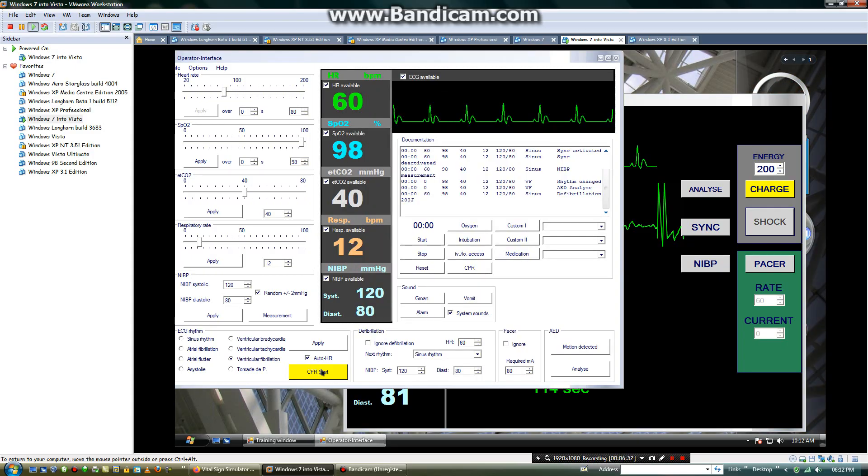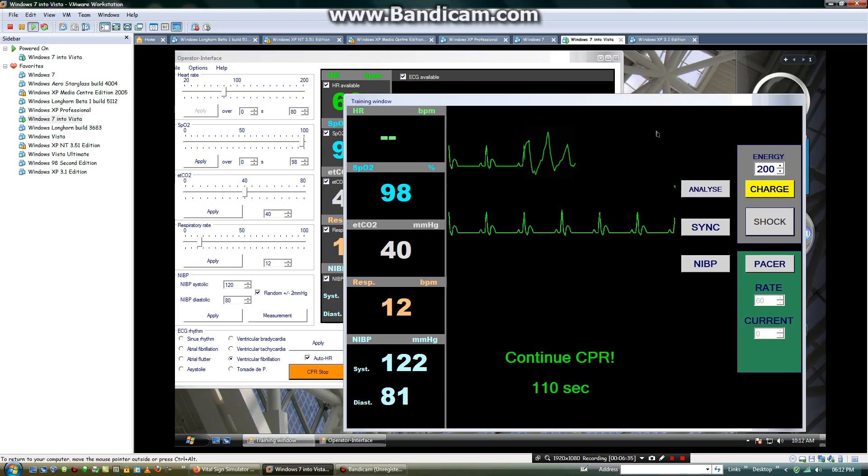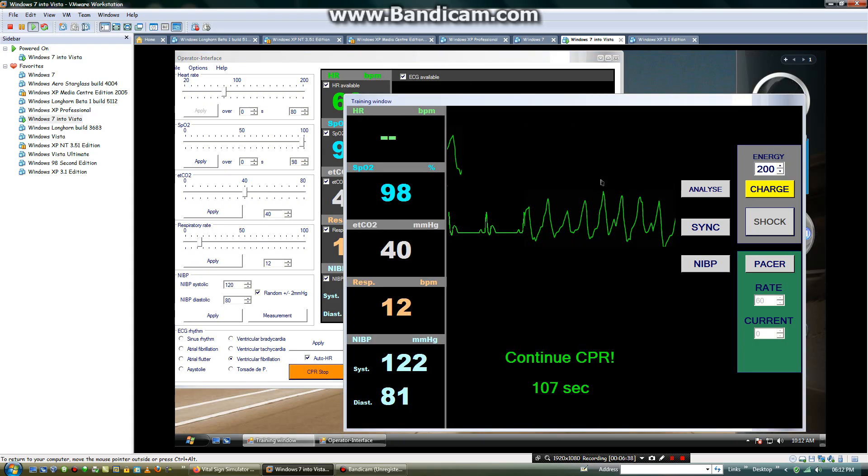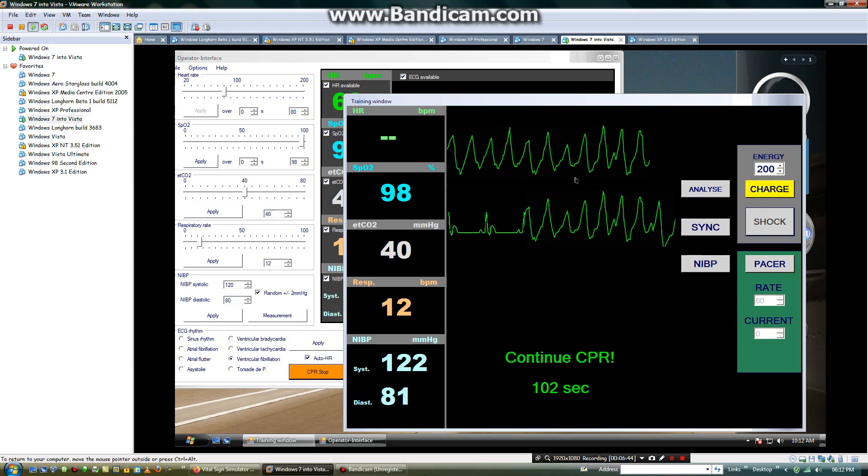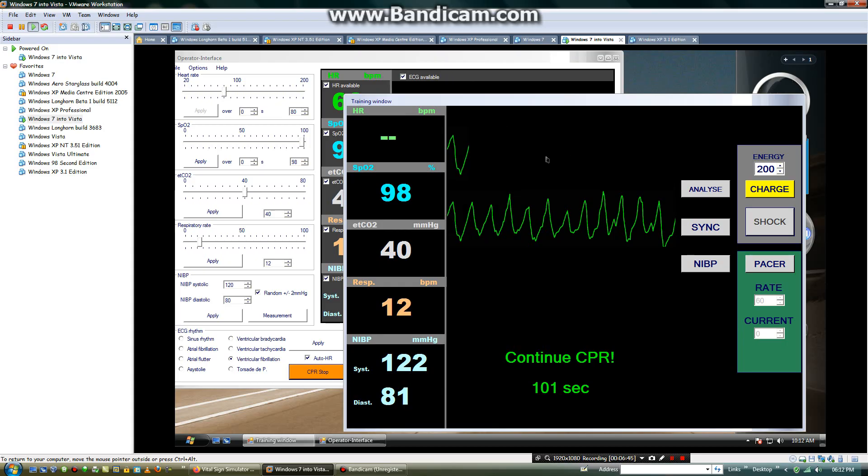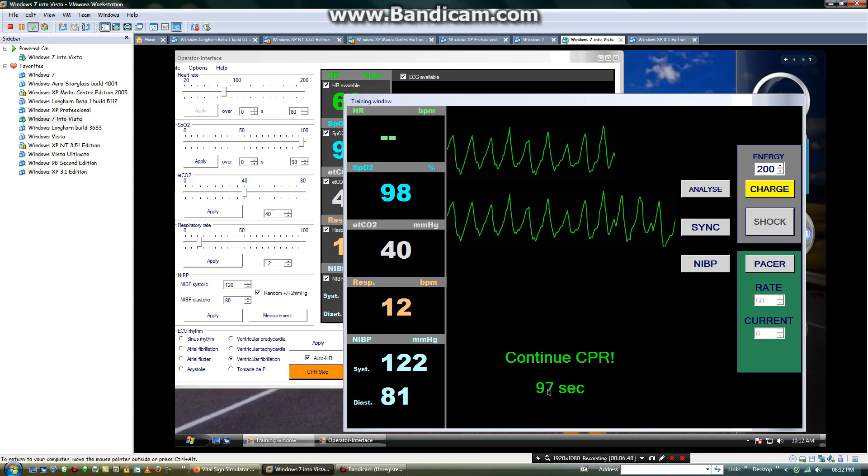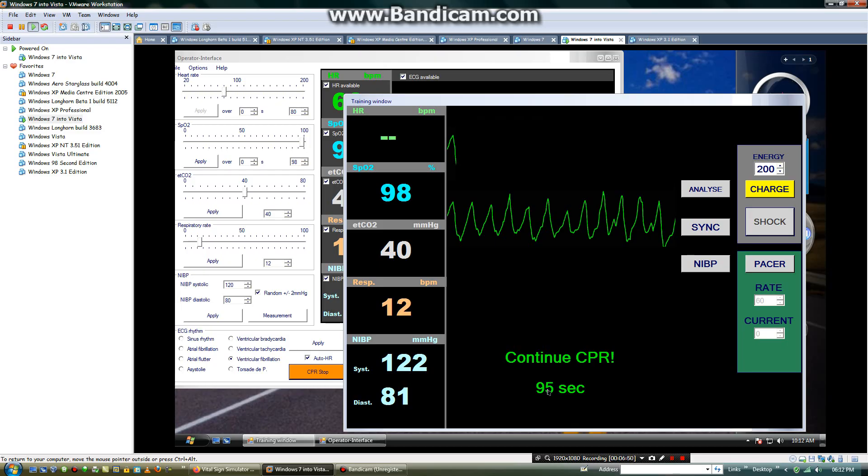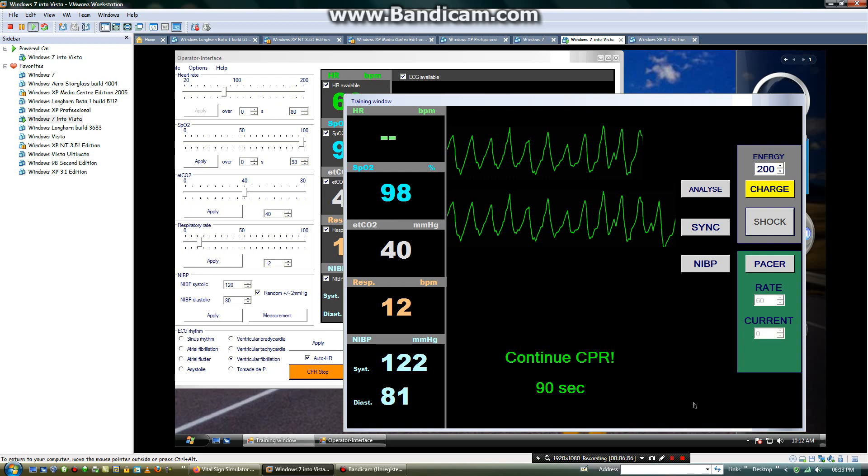Then you will click start CPR. Then it will start to show the EKG rhythm in CPR motion artifact. It will give you about 121 seconds. You can see it's counting to 93 seconds. Then it will further decrease when the CPR will start.